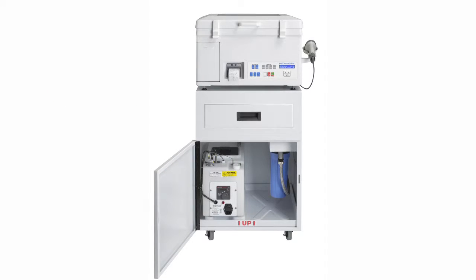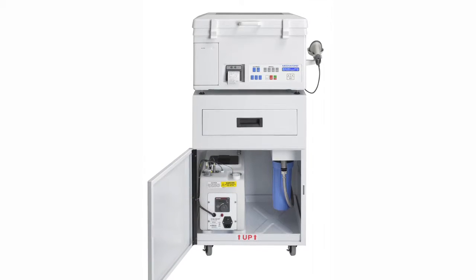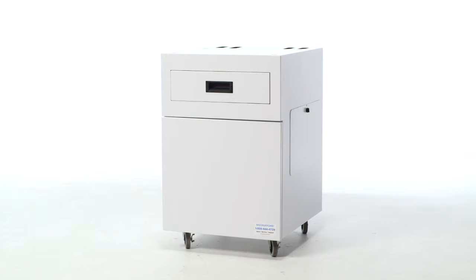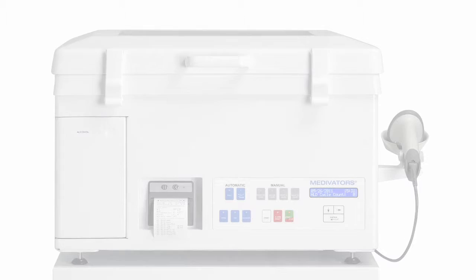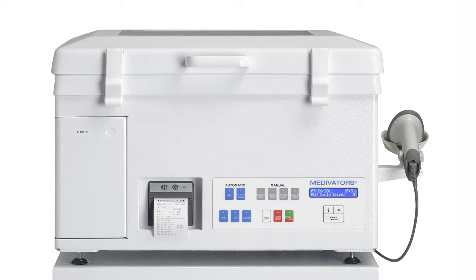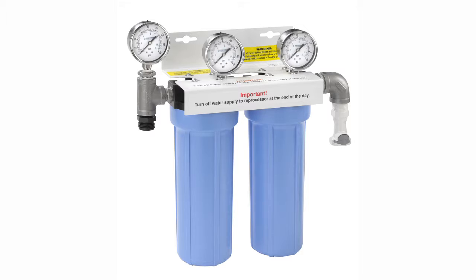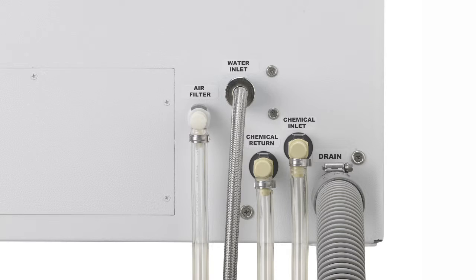Installation is relatively simple, and no special skills are required. Optional items that may be included with the CER Optima are the disinfectant transfer pump, mobile transfer cart, and the vapor management system. The main components of the CER Optima installation include the CER disinfector unit, the disinfectant reservoir, and the water filtration system. The three components attach together via supplied connection tubings, which are used for the CER's water supply and drain, air filtration, and chemical inlet and reservoir return.